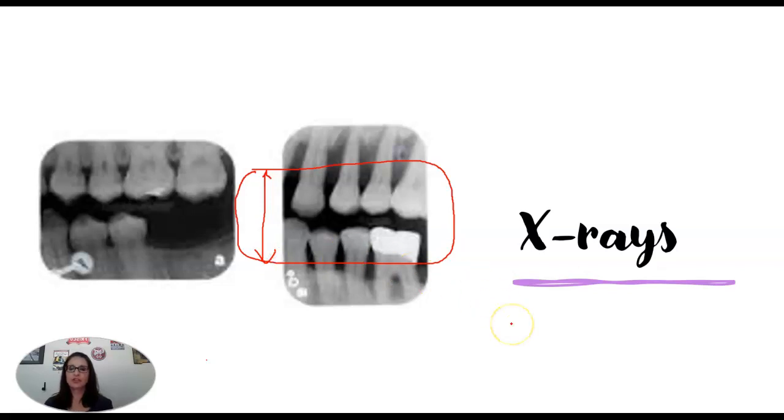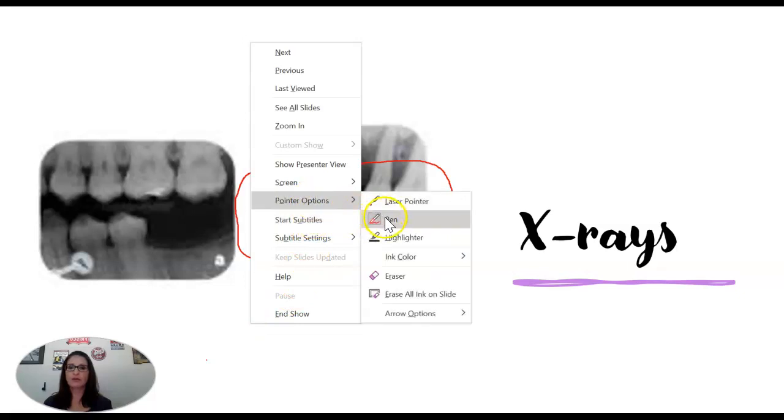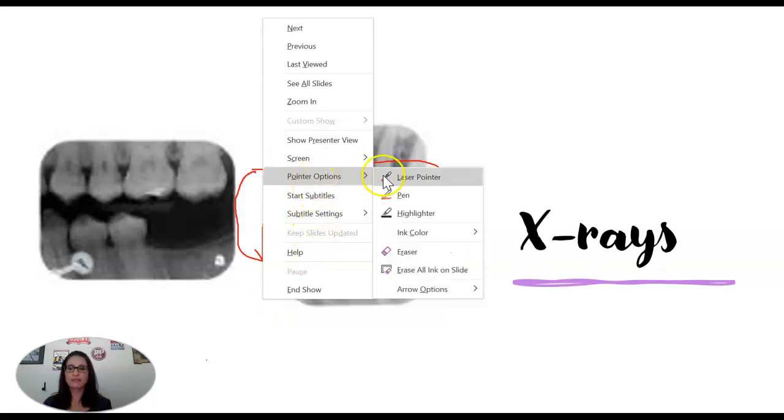We would be able to determine that this patient has bone loss. We just wouldn't be able to see the severity of the bone loss, because all we're seeing is just in here. We're not seeing anything out here. So when we're dealing with perio patients, our x-ray of choice is going to be vertical bite wings. Let me take that off.